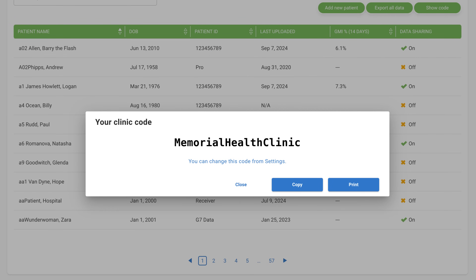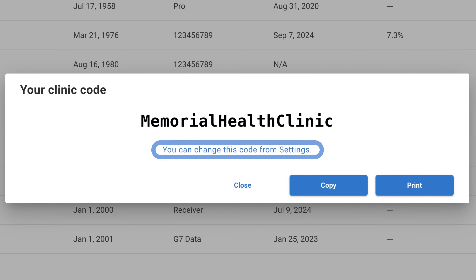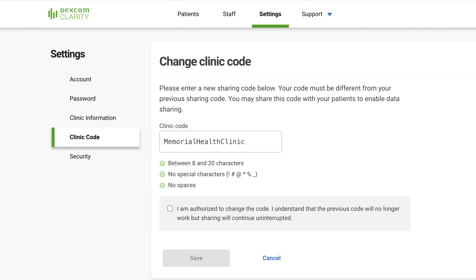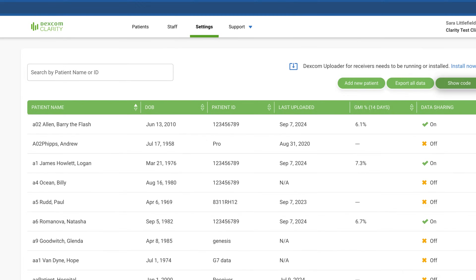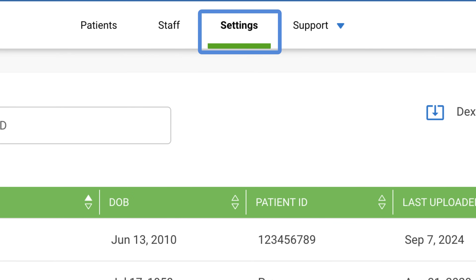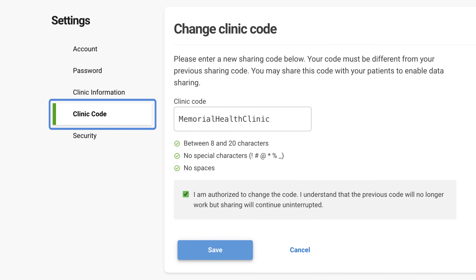If you have administrative privileges, this can be customized by clicking on the hyperlink within the show code window, or by going to settings and selecting clinic code.